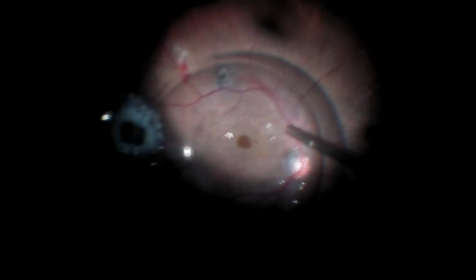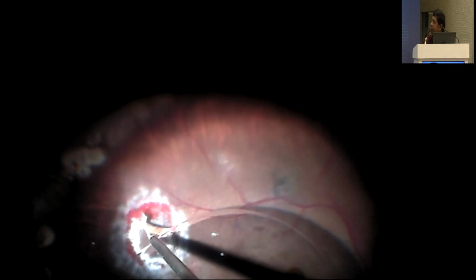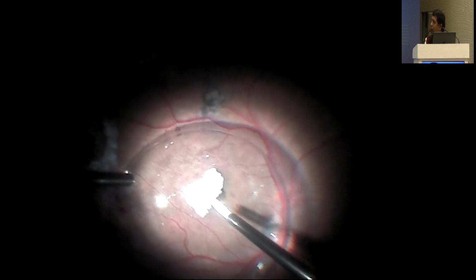Finally, it was decided to go for a retinal graft. Graft area was demarcated by endodiathermy and surrounded by laser. Perfluorocarbon liquid was injected. An attempt was made to harvest the graft. Now the graft decides to ride on top of the perfluorocarbon liquid, and it was quite tricky to maneuver it to go underneath. Finally, after some struggle, it was managed. As you can see, the graft size is inordinately larger than the hole. A hybrid port system was being used, the right-hand cannula being a non-valved one. The graft got lost even before the mistake was realized.